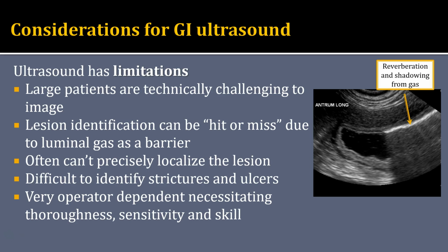We oftentimes can't precisely localize the lesion because we can't follow the intestine from stomach to rectum continuously. And then some diseases like strictures and small ulcerations are nearly impossible to identify with ultrasound. Finally, it is an advanced skill and is very operator dependent.